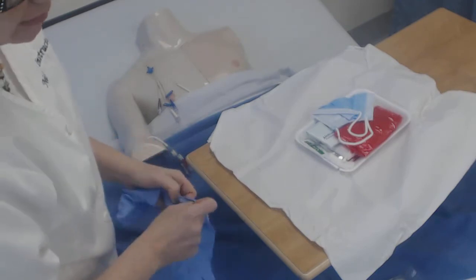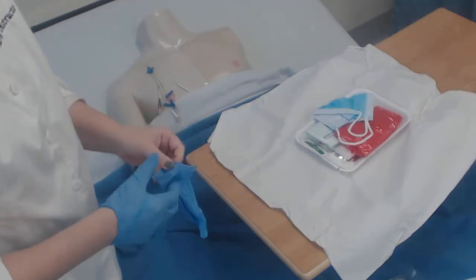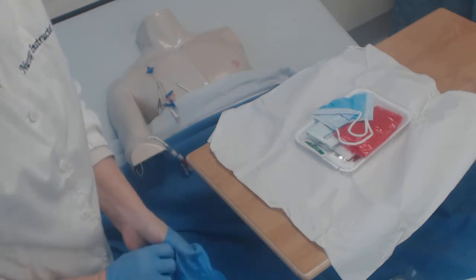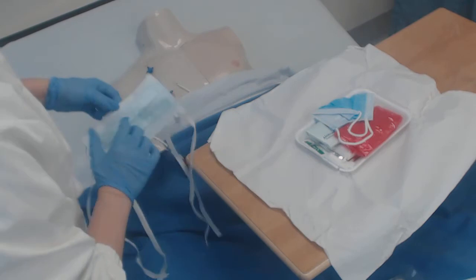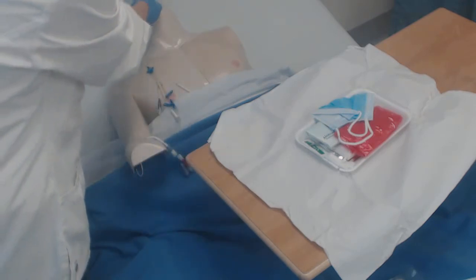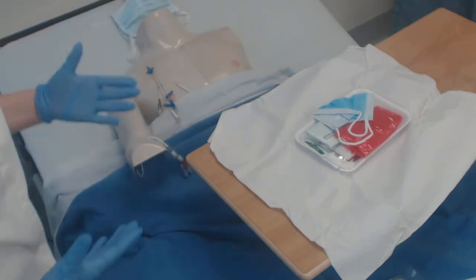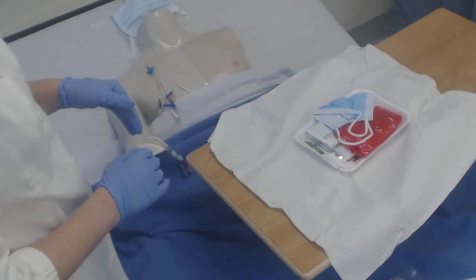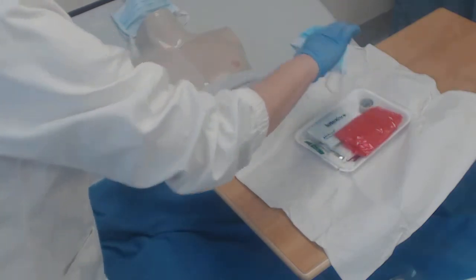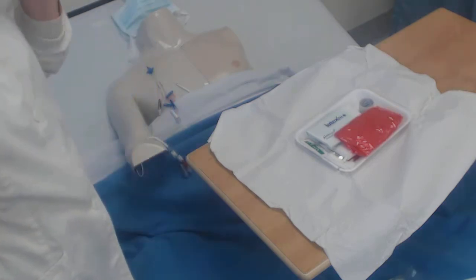Inside this kit is a mask. I'm going to mask myself and the patient. I brought in an extra mask and I'm going to place this on the patient. If the patient is claustrophobic or can't tolerate a mask, ask them to turn their face to the other side when you have the dressing open. Then I'm going to grab this mask and place it on my face.